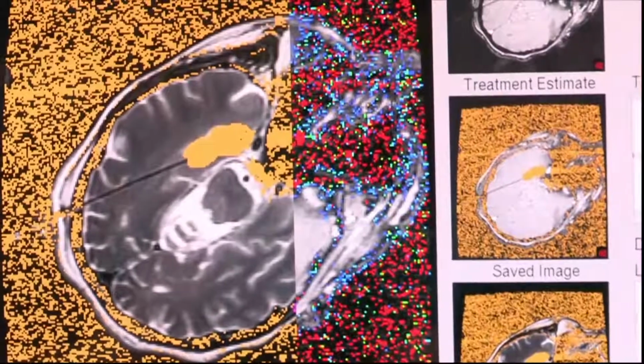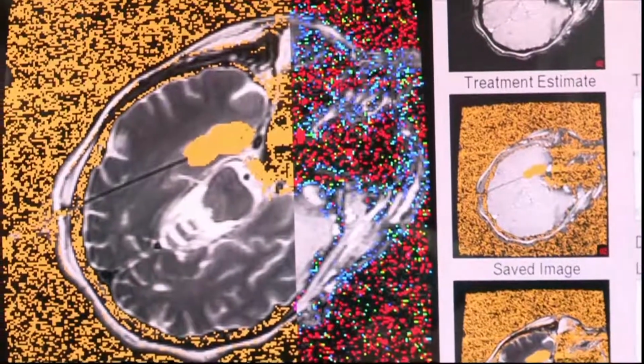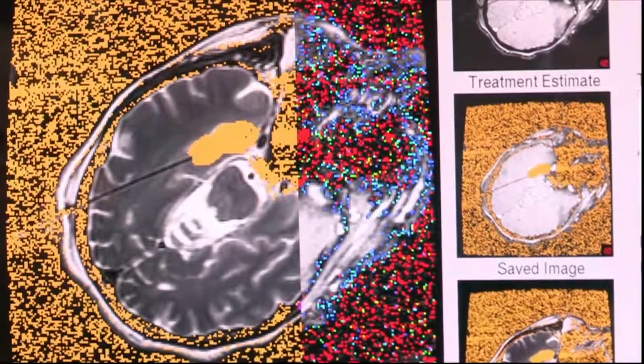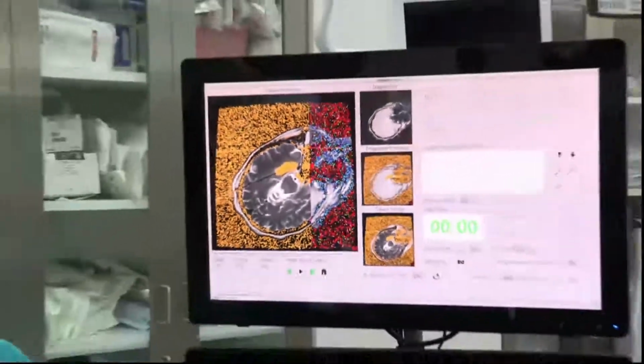Okay, great. At the end of it, we take the catheter out and put a single staple in, and they extubate the patient and go to the ICU. Most patients go home the next day.